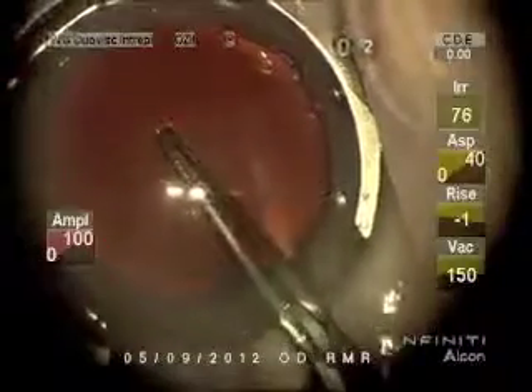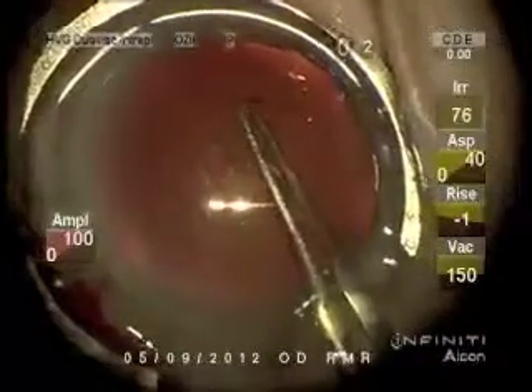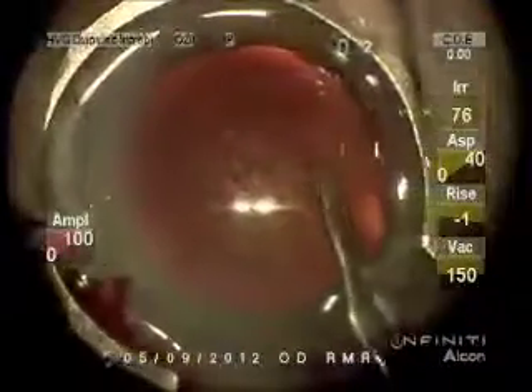I'll just puncture the capsule and push ahead to try to get a vertical tear started, which is easy to grasp with the Utrata forceps. I like to stop here at sub-incisional to re-grasp.